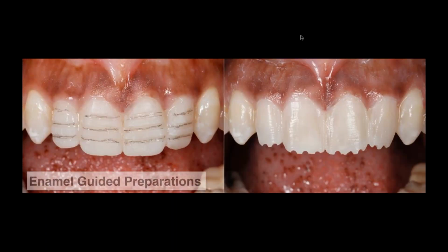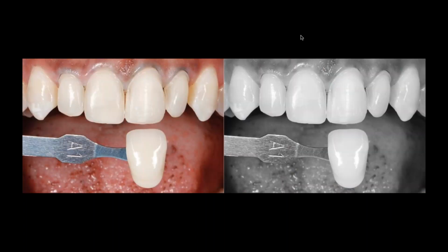So this is our conventional workflow, always making a dental facial driven mock-up. Once we have the mock-up, we scan it if we need any small modifications or fine-tuning in the patient's mouth, and then we use the mock-up as a prep guide. With our bur block, the 0.3 depth cutting bur assures me that I can create that minimal thickness but also maintain the enamel.